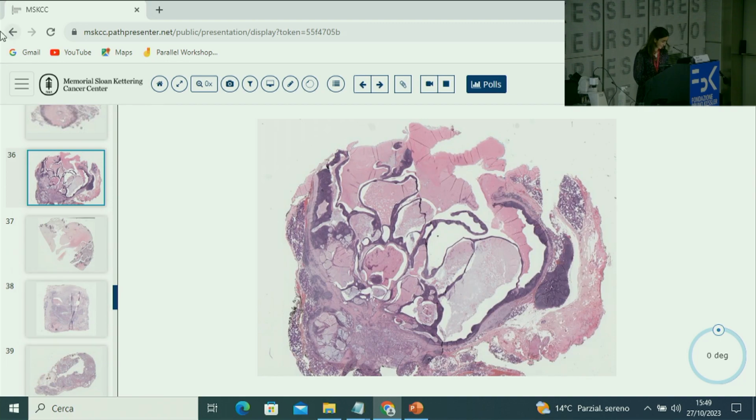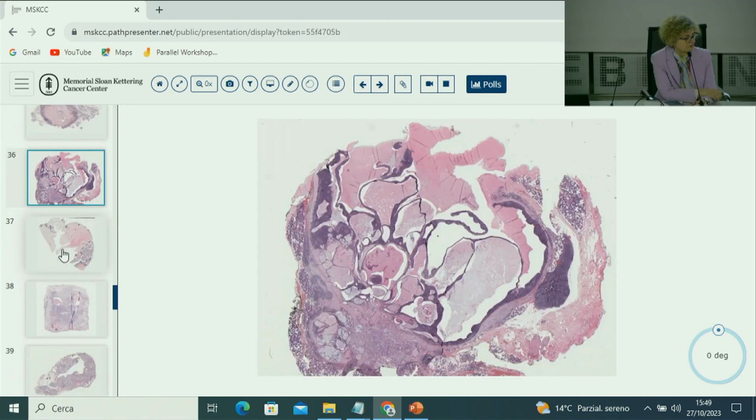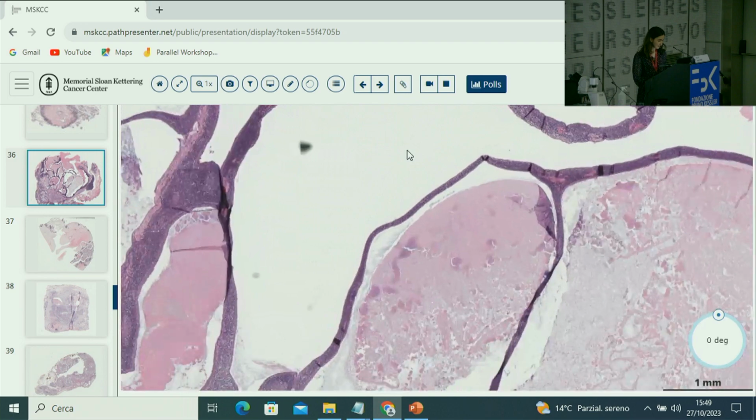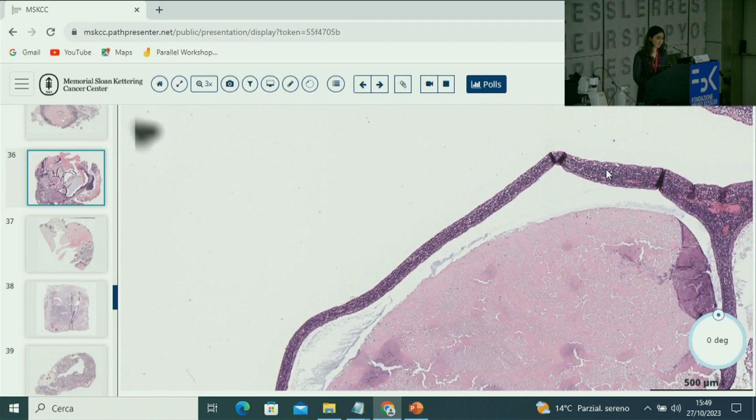Yeah, they can be very difficult to differentiate from Warthin tumor, especially on preoperative cytology. So this is Warthin-like mucoepidermoid carcinoma, and again with salivary gland, when you have the resection, look at everything because you might see clues here and there. But on small material, you have to think about everything because you might not see everything you need to make the diagnosis. So you have to have a broad differential. That's why sometimes we're limited and cannot make the diagnosis. But when we think about all the possibilities, at least we don't undercall or overcall.